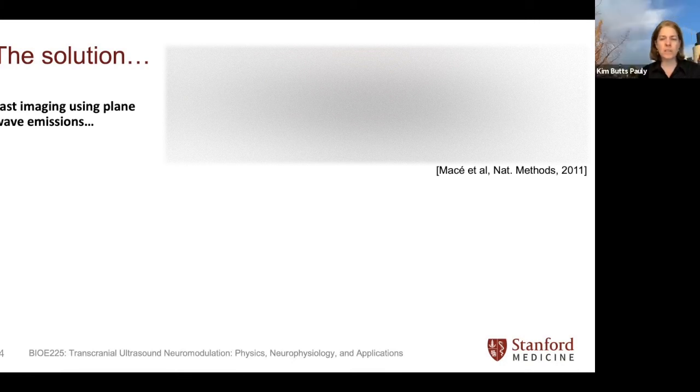We did it yesterday when we had the Doppler scanning, and instead of having a rectangular field of view that was straight down from the transducer, we angled it to the side. So they got to see that. We angled it one way and also the other way, so that there was a component towards the transducer, and then the color would change. So they had an idea that you can angle the beam. Exactly, yes. But the difference here is that most likely in that application, you're still using focused beams. Even though they are steered, they're still focused. So you're still sequentially building up your image. While here, you are building the whole image every time you transmit the pulse. Yeah. So that's the difference.